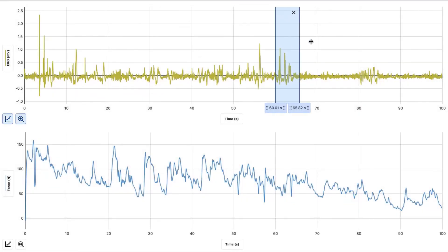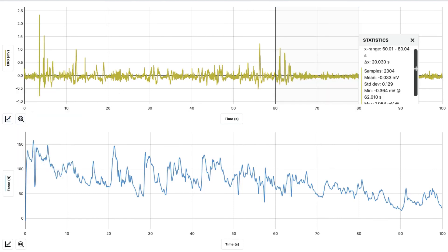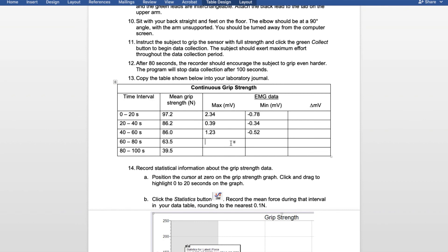Select 60 to 80 seconds. Hit the graph, view statistics, and look at the minimum and the maximum. For 60 through 80, the maximum was 1.06 and the minimum was negative 0.36.